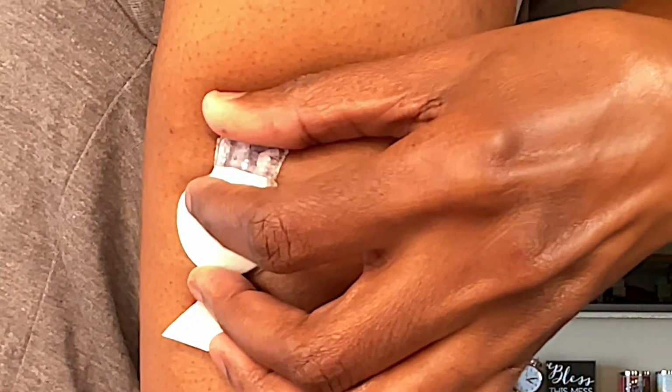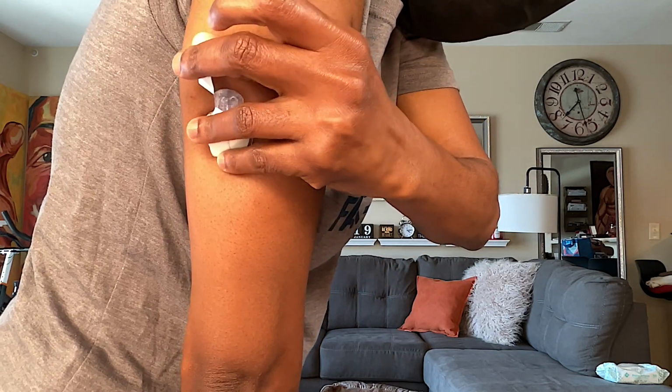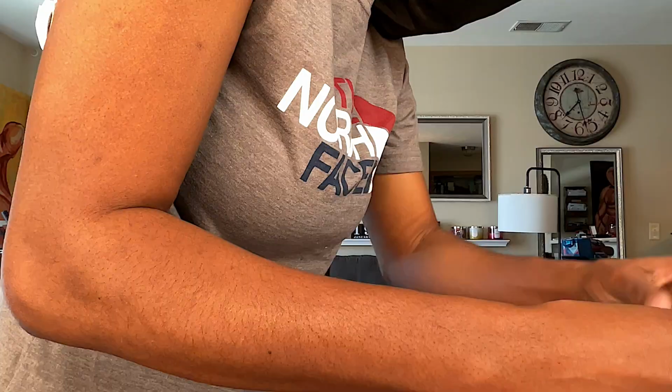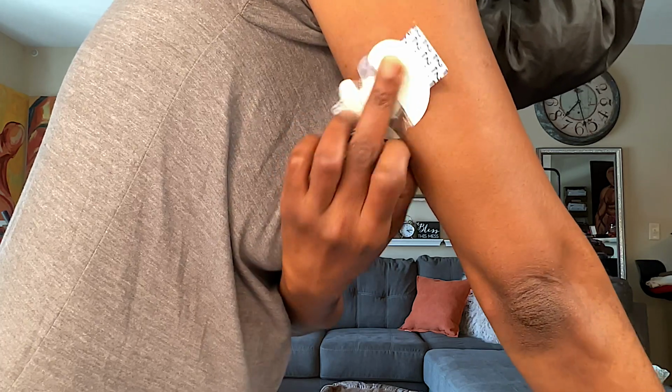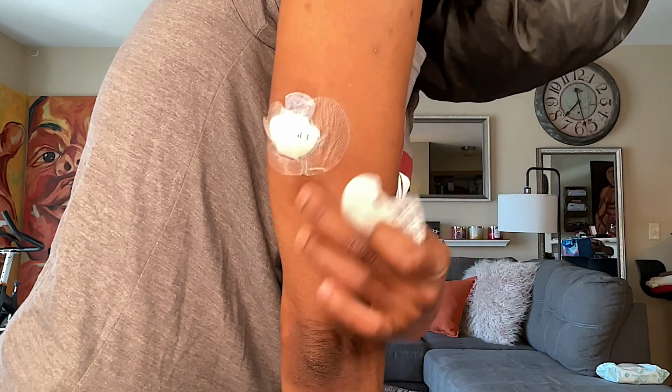Can you hear that click? Secure it. I'm gonna take that tape that I had waiting for me. Press it. Well, that sound you just heard was it telling my pump, okay, my sensor is ready.